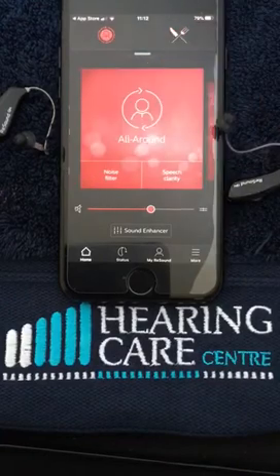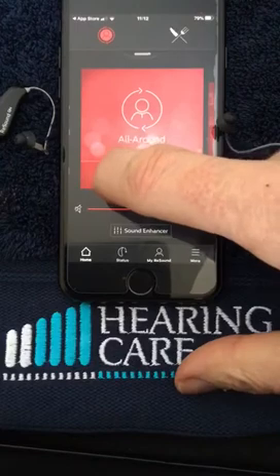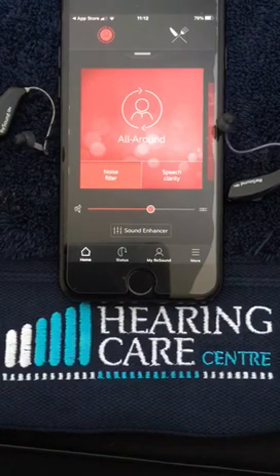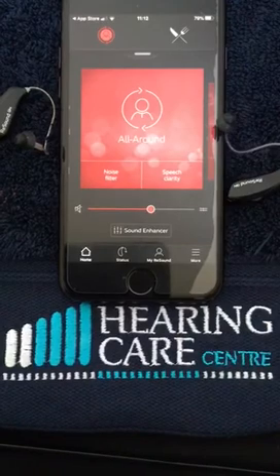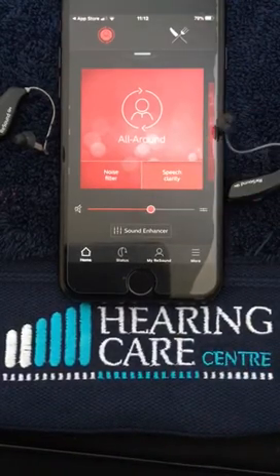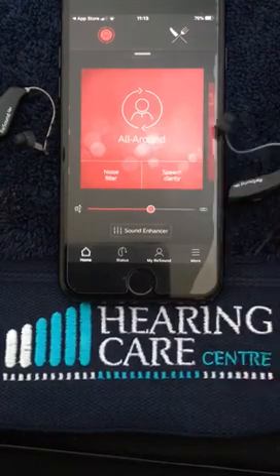Our default setting is the All Around. You'll notice we've got a noise filter button — if we click on that it will turn red and reduce background noise and unwanted noise in noisy situations. To remove it we simply click it again. Speech Clarity enhances speech and directionality, again useful in noisy environments. To remove it, simply click on it.